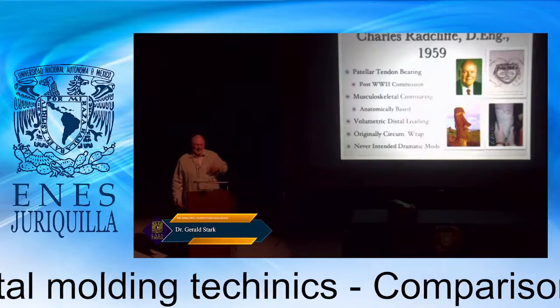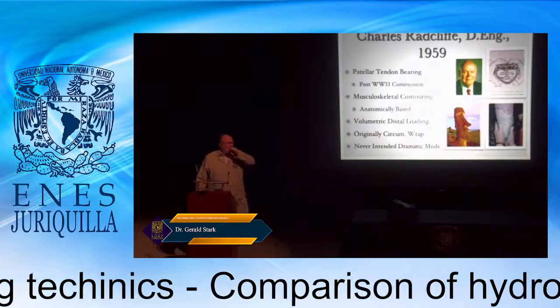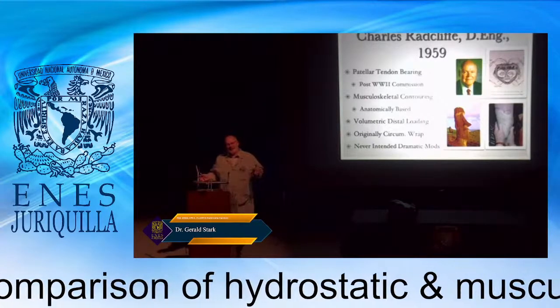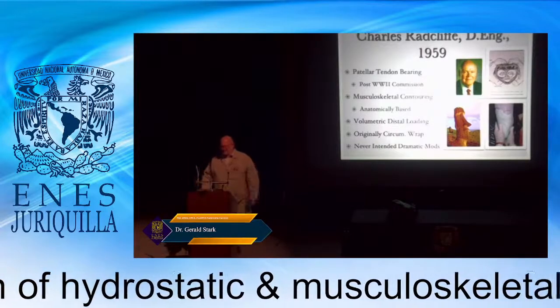and I think I got a much better presentation. We'll talk more about this, but the reason this isn't as popular is because the more you press on the limb, the more you might have liner breakdown. So the question is, are we fitting a liner or are we fitting the patient?